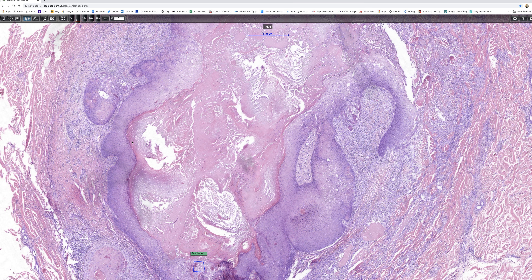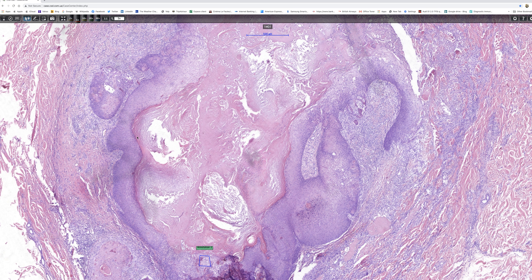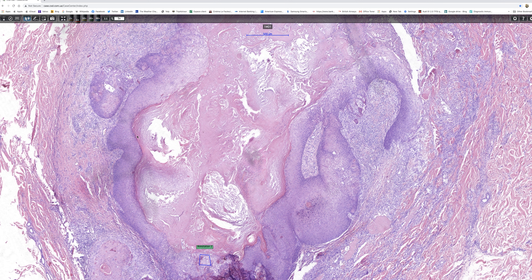I'll leave you with that low-power view, and if you memorize or get that image into your mind's eye, then you'll have the perfect Verrucous cyst. Thank you very much for your attention.